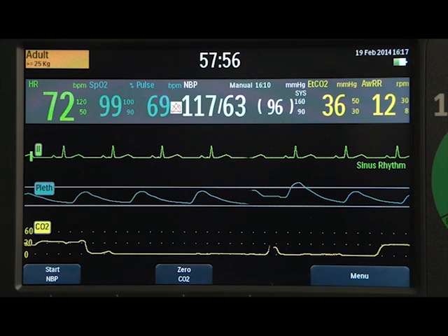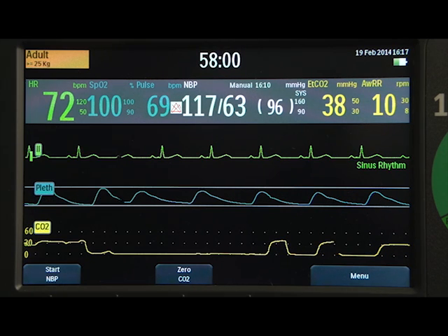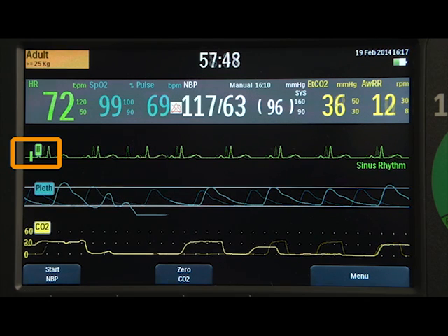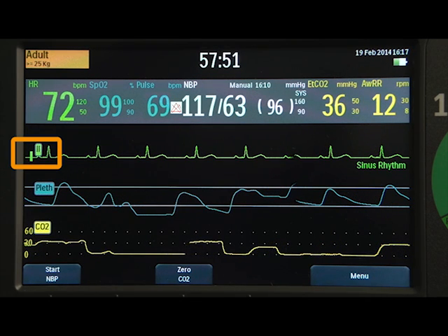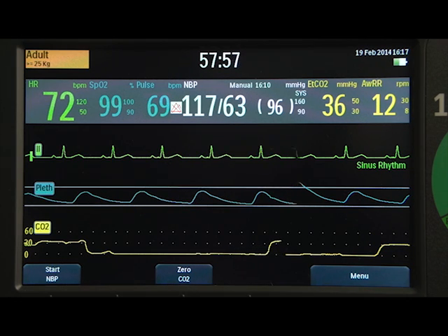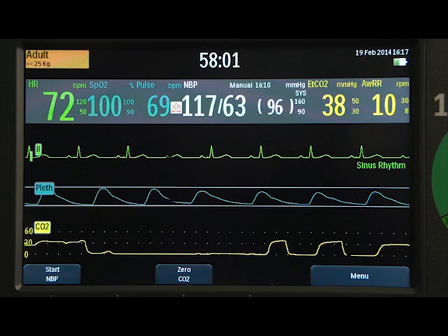Wave Sector 1 will only contain an ECG waveform, which is used by the arrhythmia, heart rate, and AED analysis algorithms. It also includes the ECG calibration bar and rhythm label. Wave Sectors 2 and 3 are automatically populated when parameter cables are connected. If the parameter source is the configured choice of a particular wave sector, it is displayed in that wave sector when available.